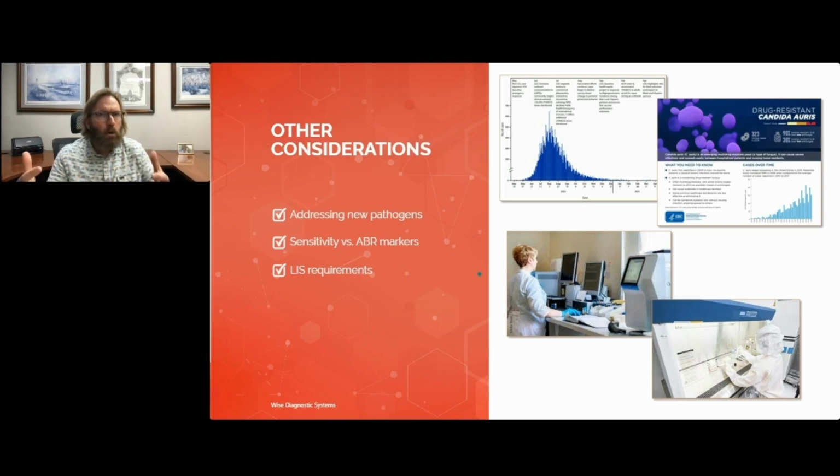So you still meet the end goal, even if there is a chance that that amoxicillin potentially could have treated that E. coli. So that's just something to keep in mind as you're doing the testing, and especially if you have clinicians that are new to the PCR results, if they have these types of questions.